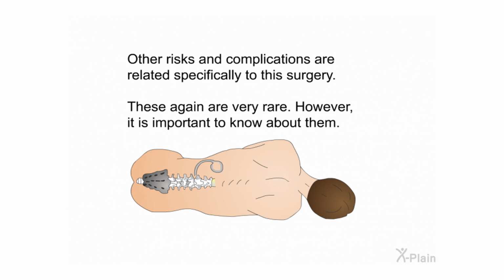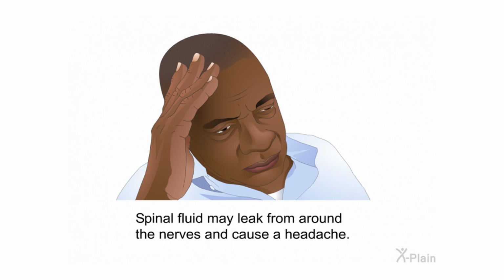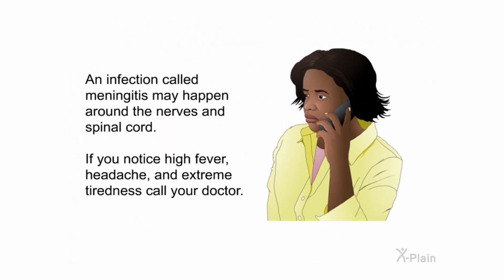Other risks and complications are related specifically to the surgery. These again are very rare. However, it is important to know about them. Spinal fluid may leak from around the nerves and cause a headache. An infection called meningitis may happen around the nerves and spinal cord.